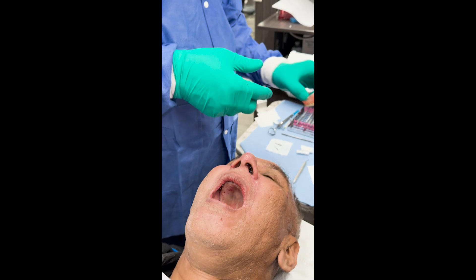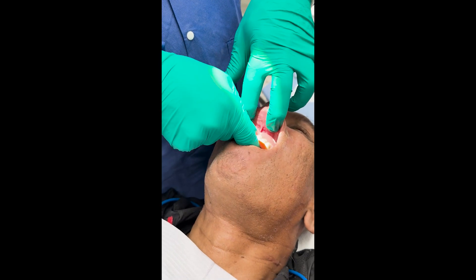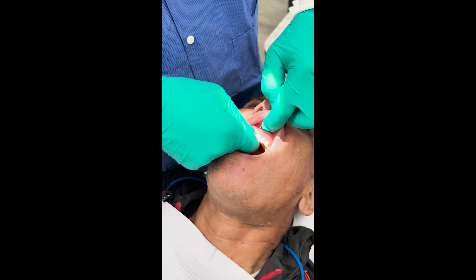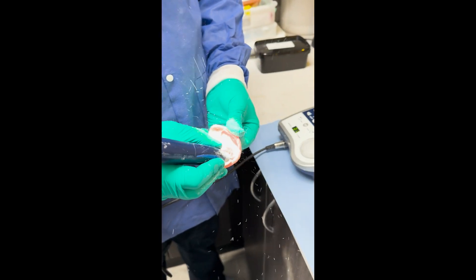Now what we're going to do is — we hollowed out his existing denture so that it could go over the implants. It's rubbing a little bit, so I'm going to trough it out just a little bit more.